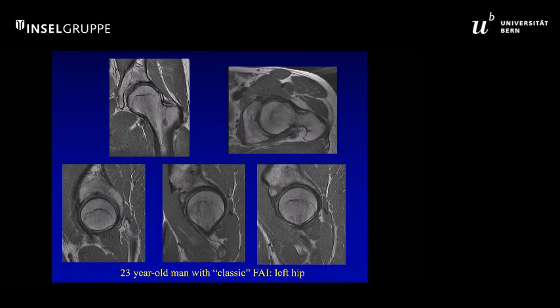So when we think about the male pattern, there's the classic male pattern, often with a big anterior offset. It's also important to think of the 3 dimensions of the hip to look posteriorly, particularly if pain is more in extension as opposed to flexion and internal rotation. See an anterior labral tear and a large focus of ossification anteriorly.